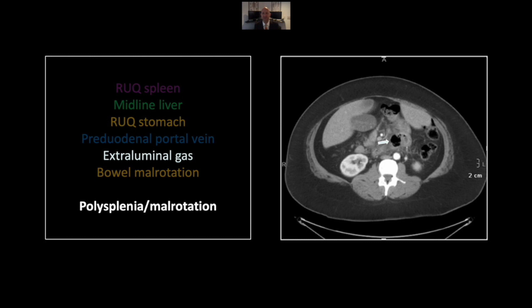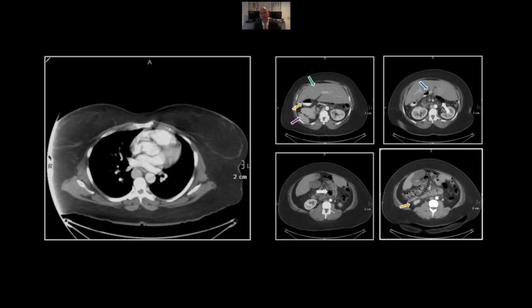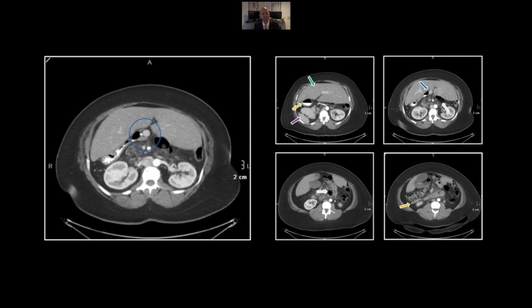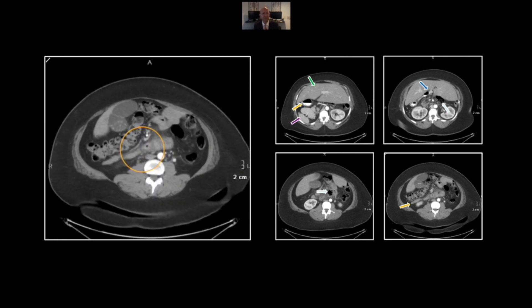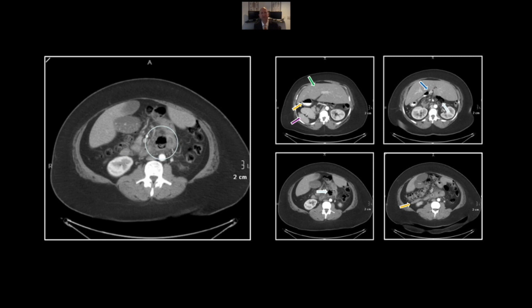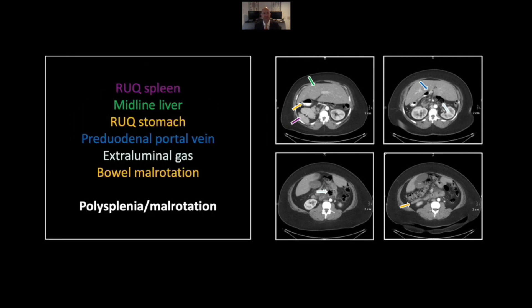There is the extraluminal gas right there. The bowel malrotation is really visible here in the right abdomen. These are redundant loops of duodenum, all stacked into the right upper quadrant, or right retroperitoneum, prior to crossing over as the third portion of the duodenum — clearly a malrotation. It doesn't have the distinct second and third portions of the duodenum as you'd expect. There are the spleen and the stomach, the pre-duodenal portal vein. Watch the loops of small bowel go around and around before crossing the midline, and then ultimately there is the perforation with associated stranding. That is a case of polysplenia with malrotation and an associated perforation.